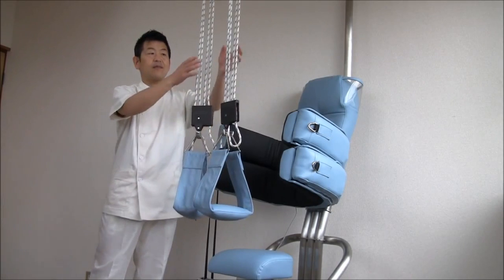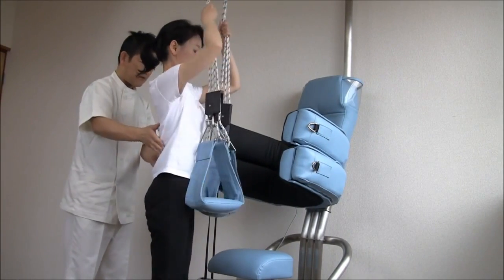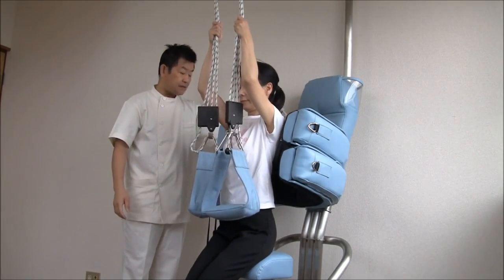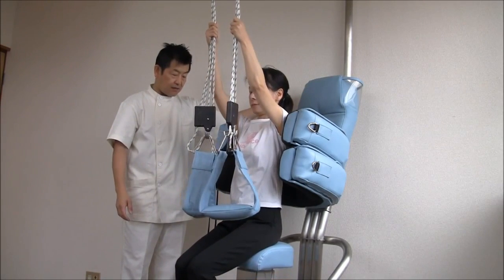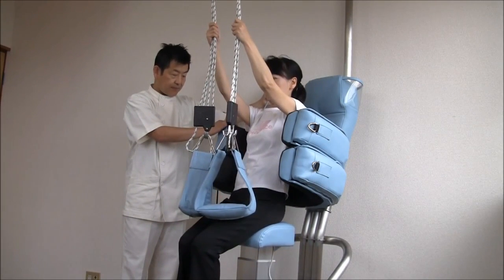Chapter 1. How to set up the patient in Protec. Have the patient grab the rope high and rotate 180 degrees while having the patient sit. Adjust the seat to a proper height for the patient. They must be seated snugged against the back.